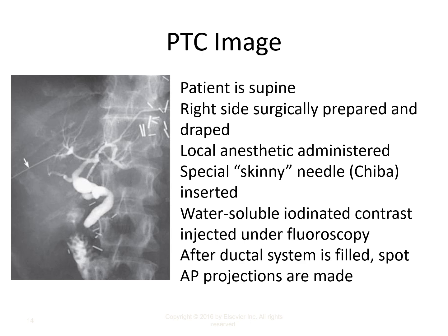This is a straight AP. You can tell by the pedicles and the spinous processes relative to the thoracolumbar region where we happen to be doing the radiograph. So notice that the common bile duct overlies a portion of the spine and parts of the hepatic ducts overlie a portion of the spine.